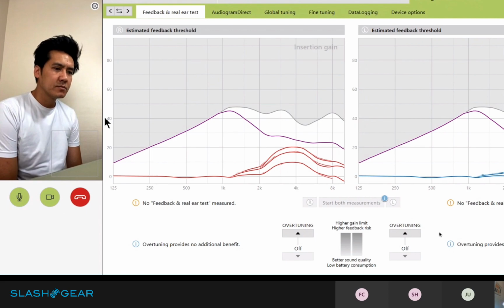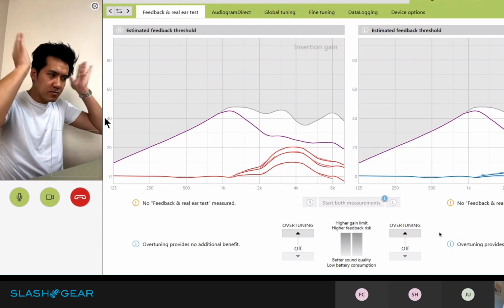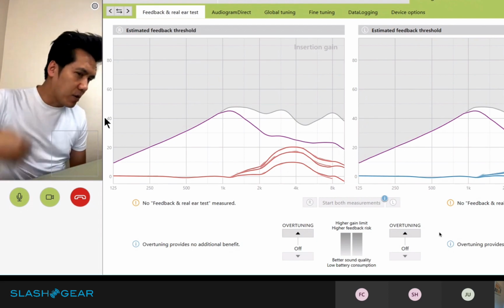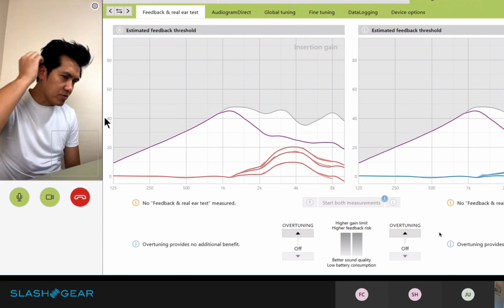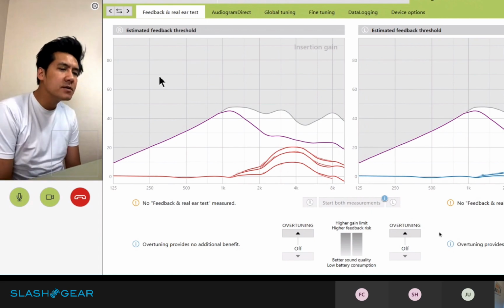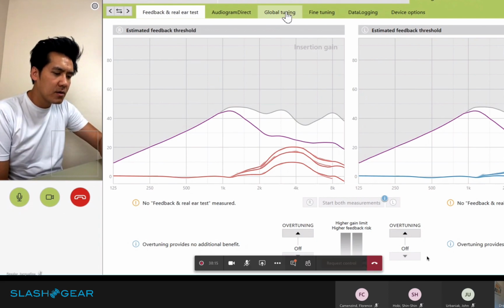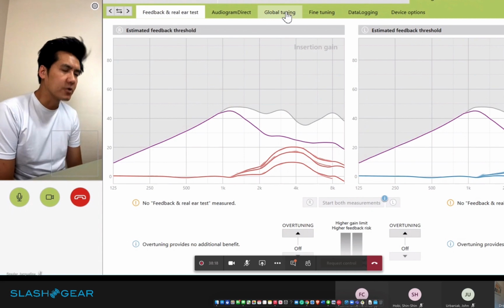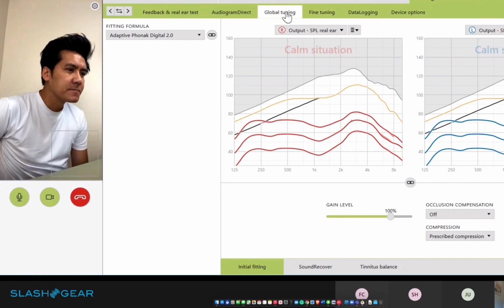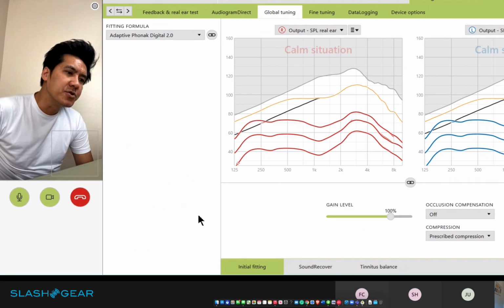It is normal if you're really pushing up against it. That's normal. But if you're trying to give someone a hug and you hear it, or you're walking close to a wall. What about my hair? Sometimes when it rustles against the microphones, I can hear it a little bit. Okay. Is that normal as well? A little bit stronger. Yeah, so I can make it just a little bit stronger, and it doesn't affect the gain. Okay, that would be great. As long as the gain is good. What's the occlusion compensation?